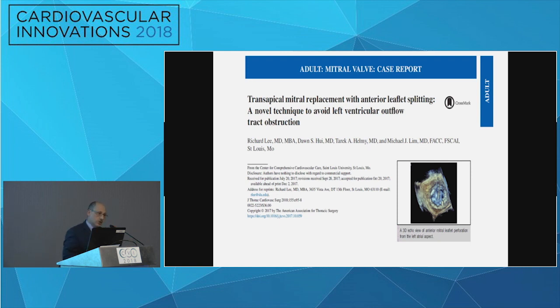The risk of developing LVOT obstruction applies to any prosthesis developed or implanted in the mitral leaflet. So I've talked to several of the people who are involved in the trials, and Alan may actually chime in on this. A significant portion of these patients are excluded if there's a risk of LVOT obstruction. And because the trials are feasibility and safety and efficacy, they don't want to muddy the waters with any potential complications. So if you have an anterior leaflet that is redundant and potentially would be pushed into the LVOT, using LAMPOON or using the translocation technique may be of great benefit, especially the fact that if you're using a transapical approach, this is fairly easy.